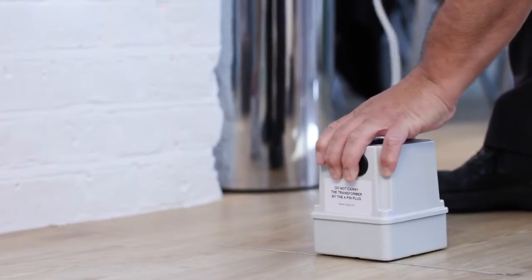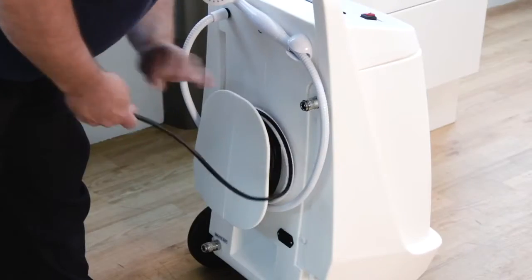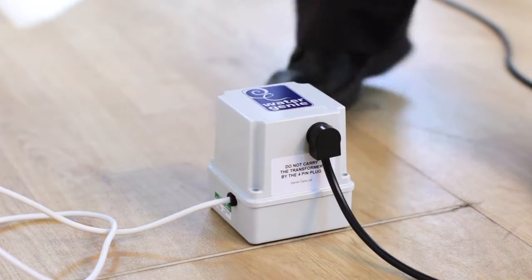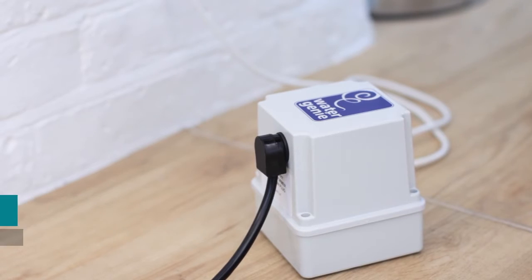Plug the transformer into a socket. Never pick up the transformer by the leads. Then unwrap the power cable from the Watergenie unit and plug it into the transformer. Warning: at all times keep the large transformer box out of the wet area.